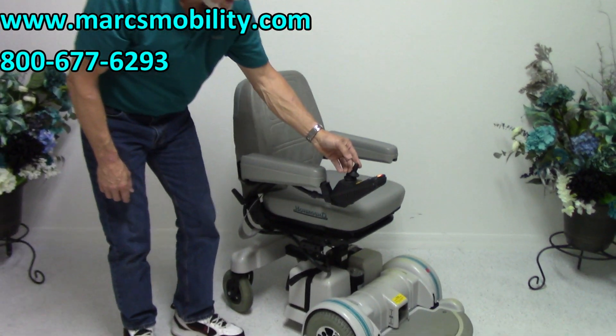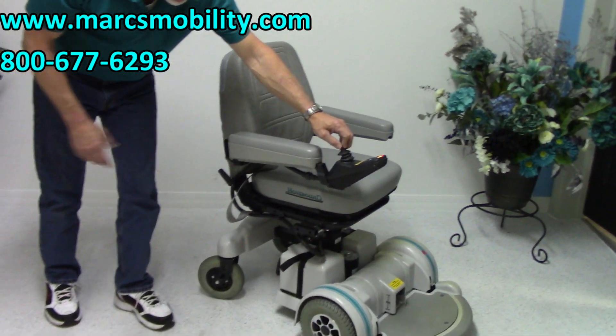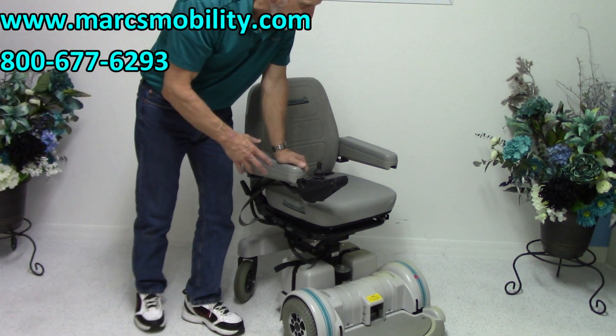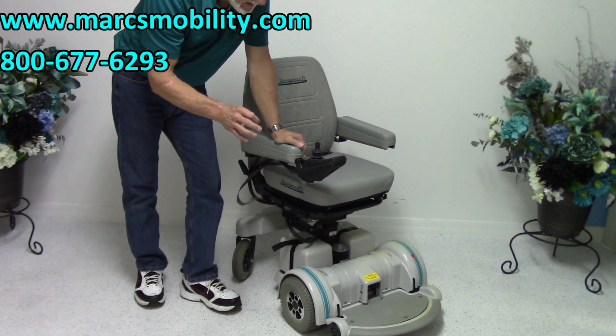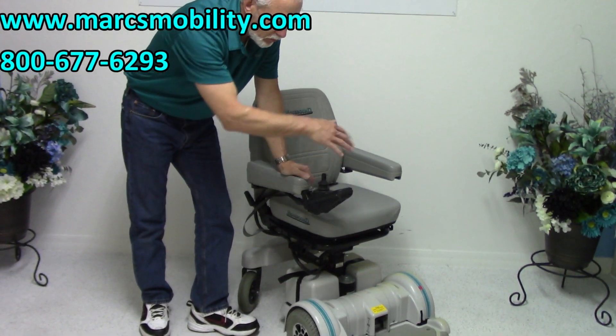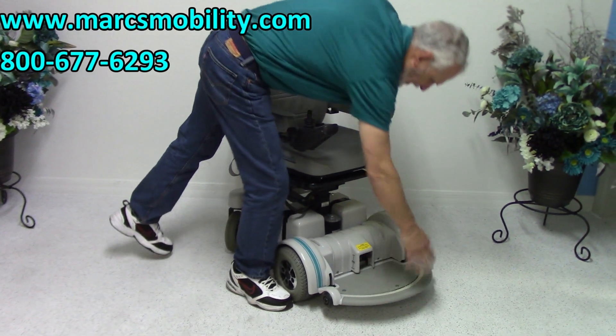Now we're back to driving. This power chair is practically new. It's a Hover-Round, made right here in Florida. It's one of the best models from one of the best companies out there. They're famous for their round footplate.